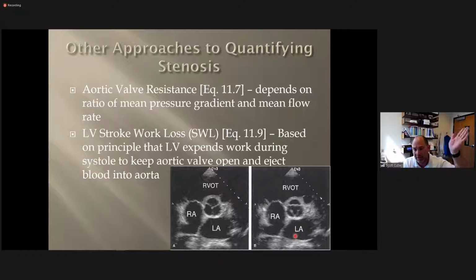In addition to that, you could look for things like dilated vessels, hypertrophy of the left heart, and maybe even a dilated left ventricle. Those are sort of secondary signs. But I definitely have to get the continuity equation complete. That's a must. You could also trace the valve if you had to, but that's certainly less of a quality.